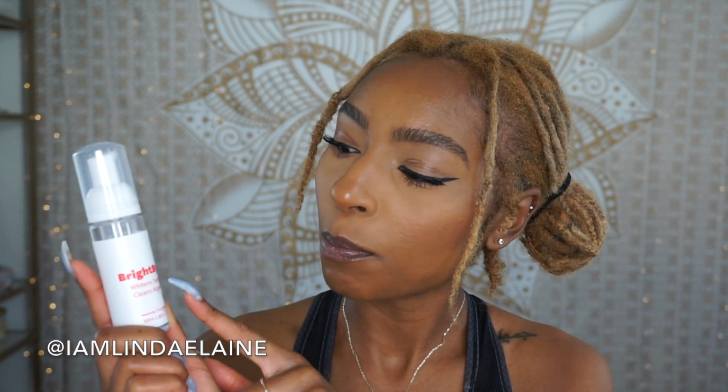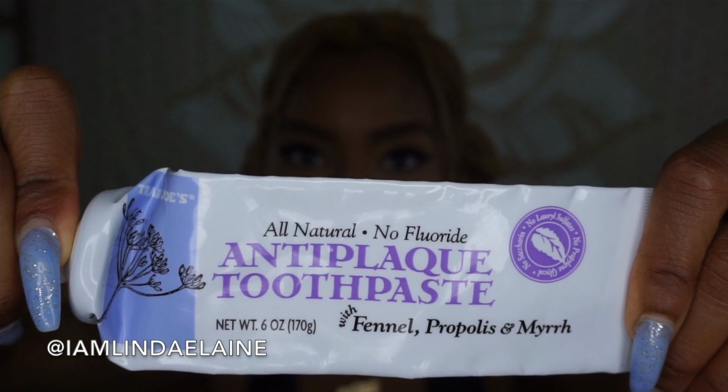How do I clean my liners is the next question. You need to keep your retainers clean. I've got that question a few times. Byte does have Bright Byte, which helps whiten your teeth and also cleans the liners. So I do use this sometimes on the go. However, I'm gonna keep it 100% with y'all. What I've been using the majority of the time to clean my liners is my Trader Joe's anti-plaque toothpaste.